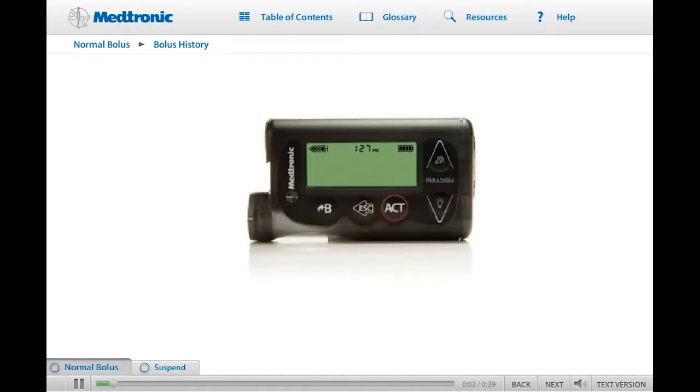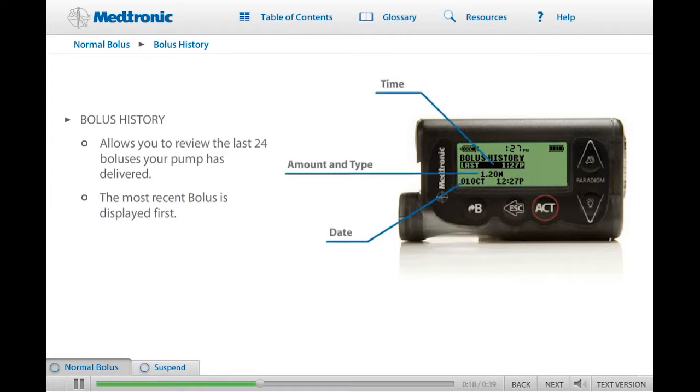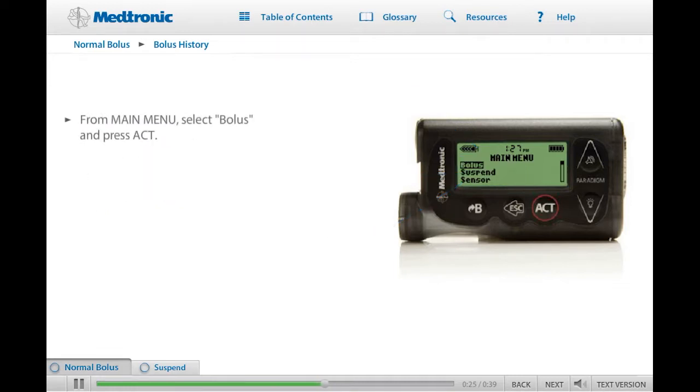Another great feature on your pump is the Bolus History screen. The Bolus History screen allows you to review the last 24 boluses that your pump has delivered. Your most recent bolus is displayed first. The Bolus History screen lists the date, time, amount, and type of each bolus. To review your bolus history, start on the main menu, select Bolus, then press Act. Scroll to Bolus History and press Act. Try accessing the Bolus History screen on your pump. Click Next when you're ready to continue.